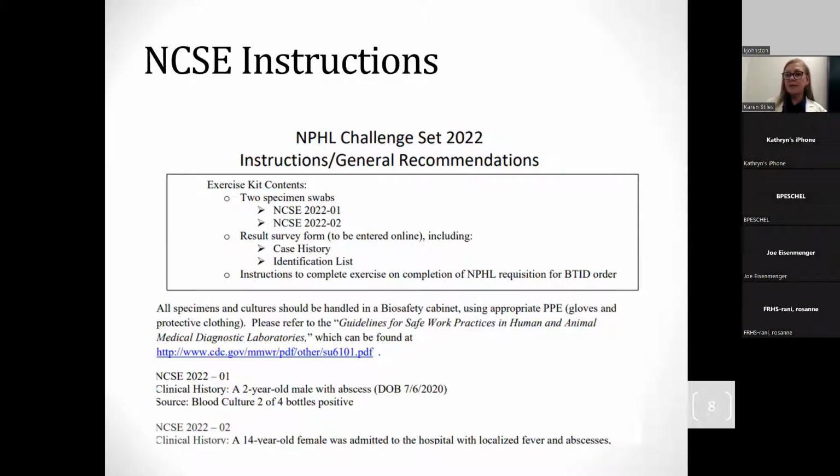But for those laboratories that cannot do the LPX, what I do is fashion what we call a laboratory developed challenge set, which is meant to be very similar to the LPX. So you've got 2 unknowns, and with each container you get 2 swabs, and you get the case histories for some of them, most of them, and of course it isn't always the best information. You don't know the total history like in real life. It's sometimes hard to dig that out.